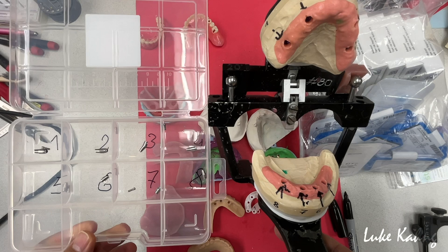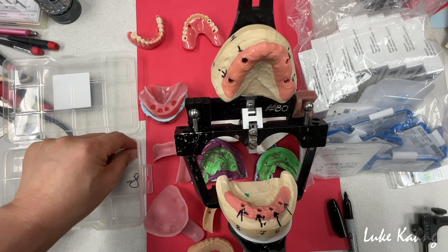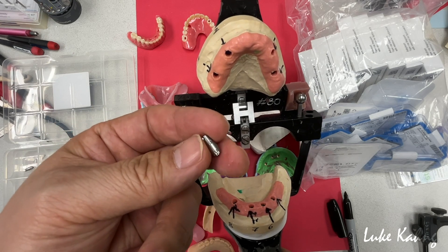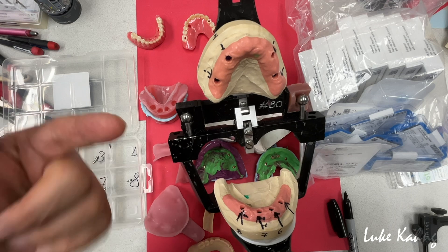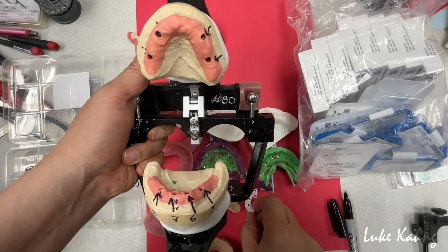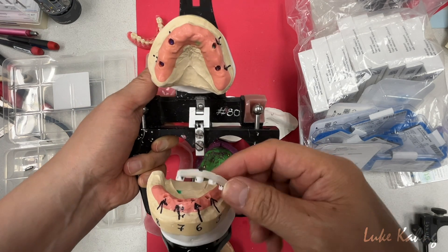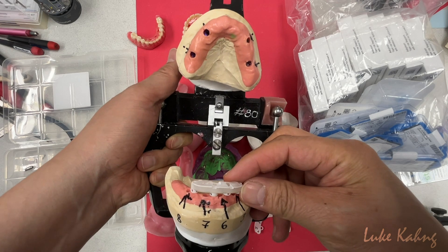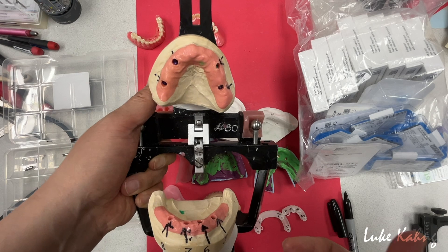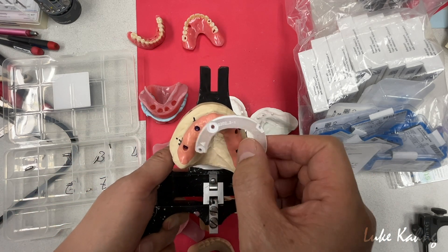So doctor has to put the specific component in there. I'm talking about the patient size. So let's say number four — you can use this. So it's a conus implant. Then after, put this four. So doctors fabricated about the verification index. So we put the number as well, and put them together on top. So this must be verified, which is what we did on our end. Same things for the lower too.